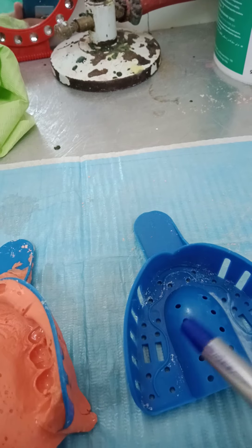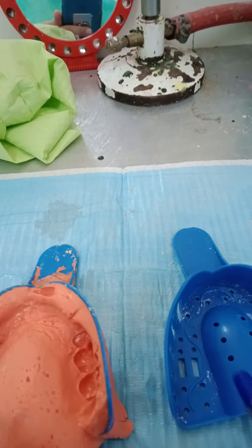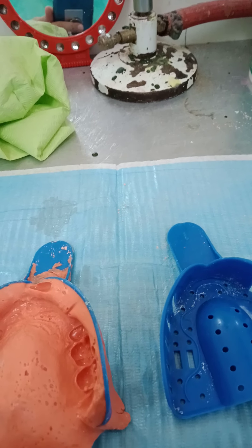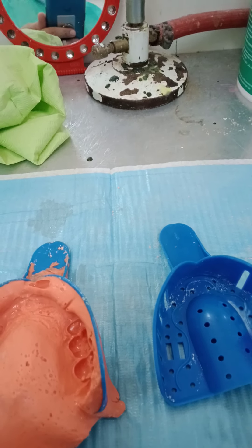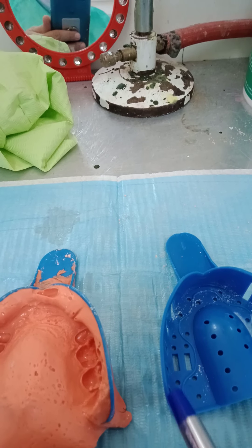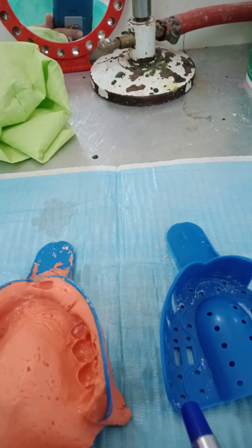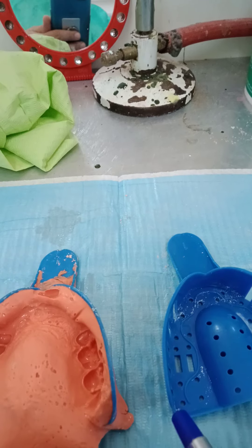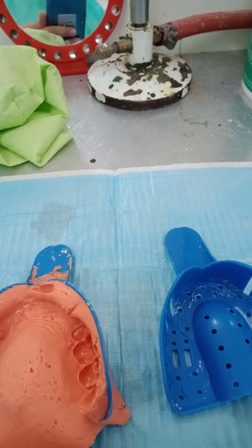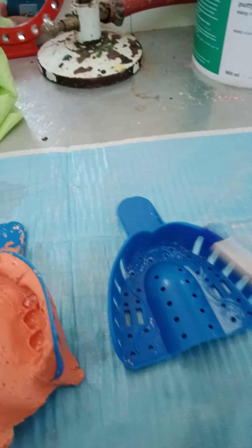Now in this area — the saddle area on the opposite side — same thing. I'm going to place a piece of compound, compress it. The tray now has one piece of compound and one piece of compound; this area is still empty. I'm going to compress the ridge here, do my border molding, and if I need a bit more border molding I could add green stick over the compound. Once this is compressed and the sulcus is border molded, that's enough for my purpose — I need to take the soft tissue correctly because I'm going to replace them using acrylic.